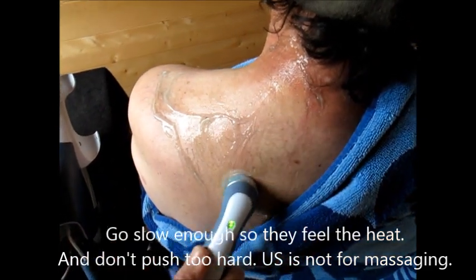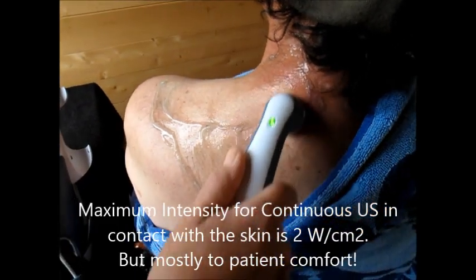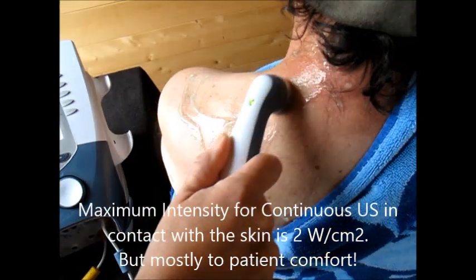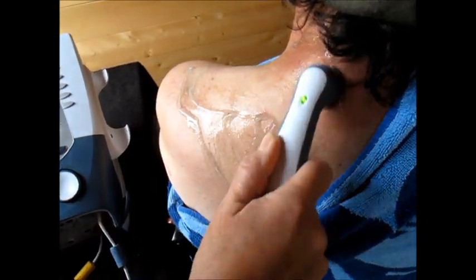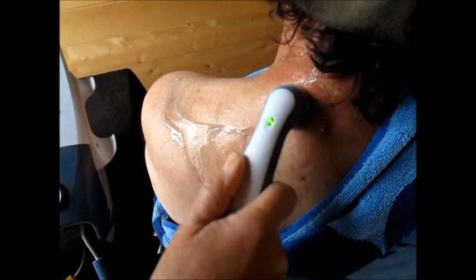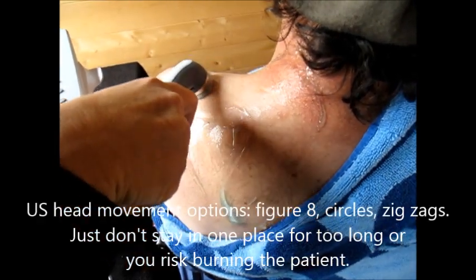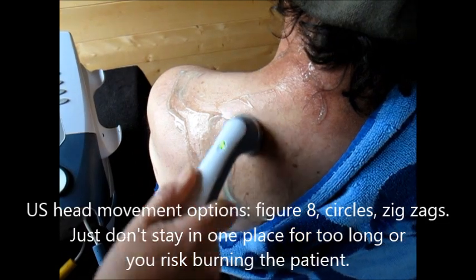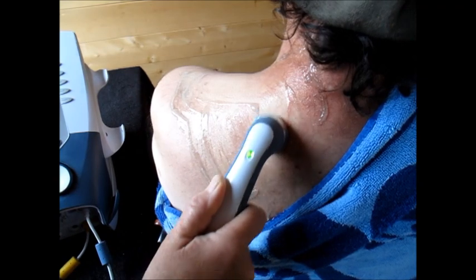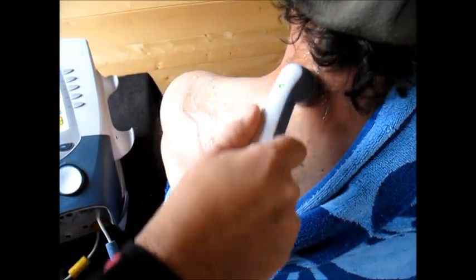Ultrasound is not for massaging. The maximum I want to go to is 2 watts per centimeter squared in a continuous setting in contact with the patient — the machine will let me go to 2.5, but I won't go above 2. You can see I'm using different techniques: they say you want to do either a figure eight or circles. You just don't want to end up doing any one area too long. I'll avoid the shoulder blade a bit more and zip over it so he doesn't get too much concentration there.